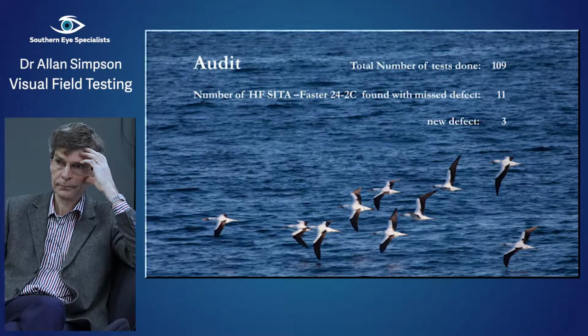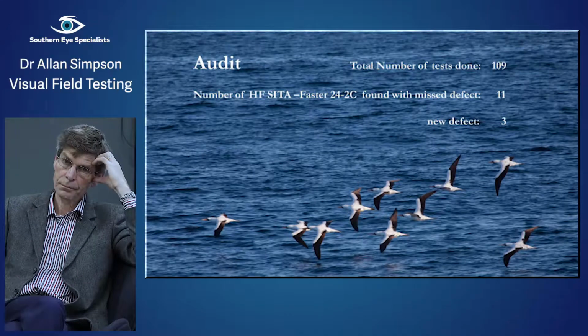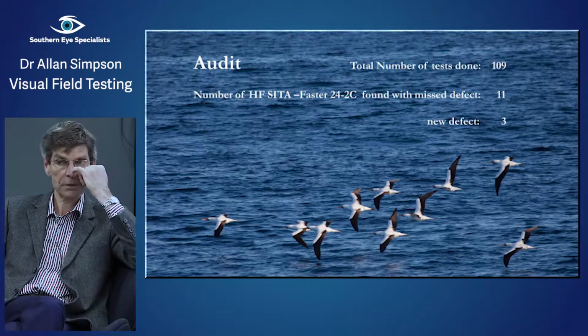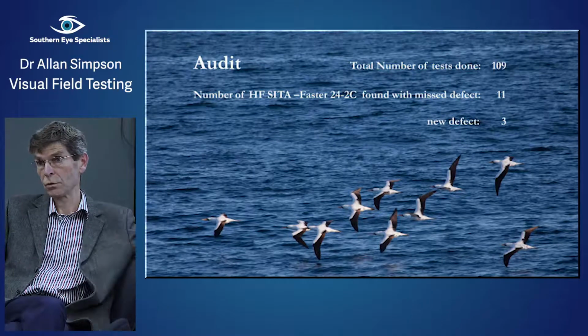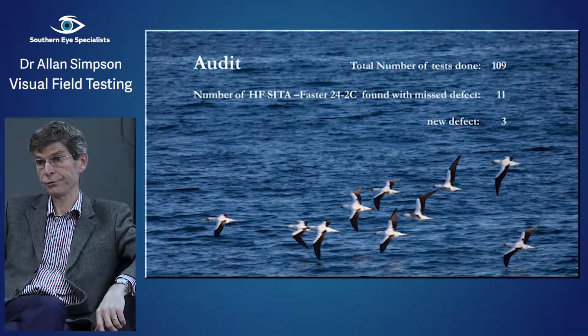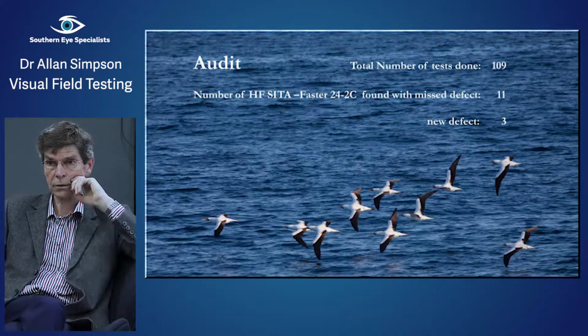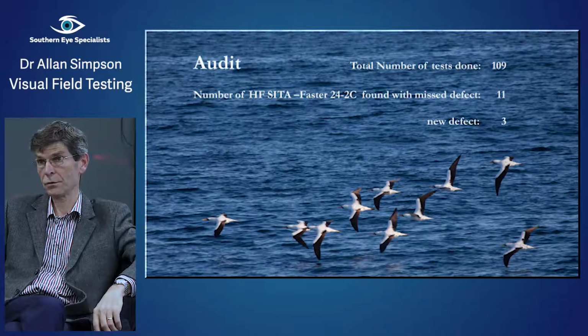Any of those tests on someone with quite severe glaucoma? Does it look different from the original test? These were all my patients for the 3 months, and there were some quite more extensive visual field losses in that 100. These are just all the ones that I picked that were different. Looking back at them, I didn't realise at the time that they were all quite similar, quite early defects. It's just the way they turned out, those 11.